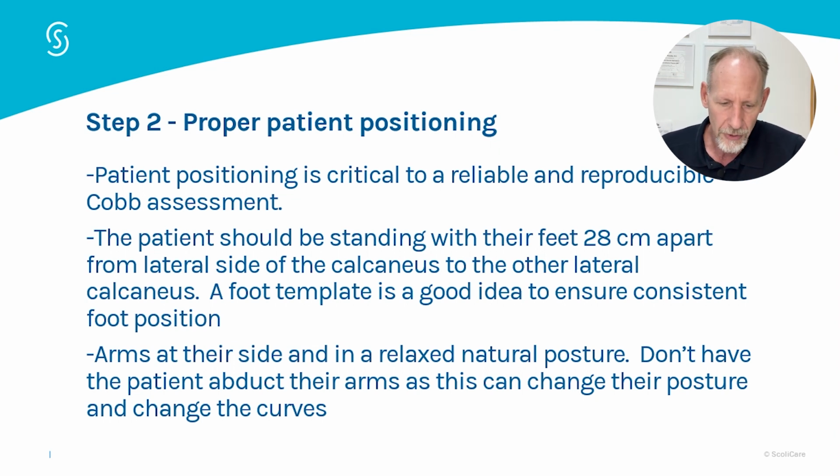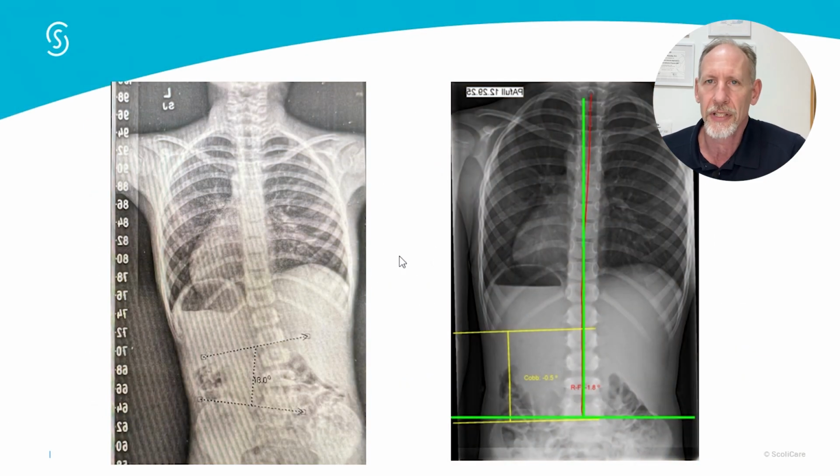This is a good example of that. This 6-year-old went to the largest children's hospital here in the Phoenix area, and had this x-ray taken because the family has a history of scoliosis, and they showed that she's got an 18-degree lower lumbar curvature. So the parents were looking at it and they kind of wondered, so they came to me for a second opinion, and I did a physical exam on the child and I could not see any external signs that she had scoliosis, and so they asked me to take a new x-ray.